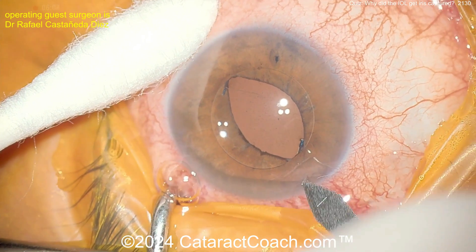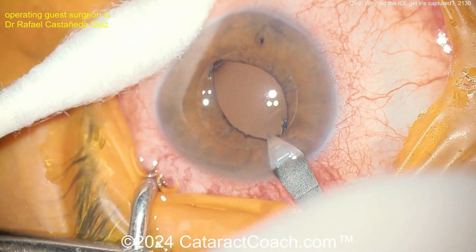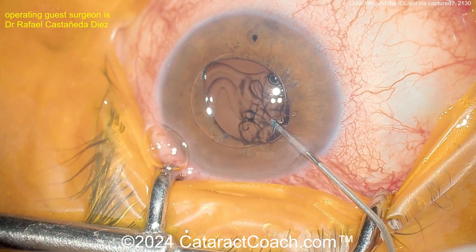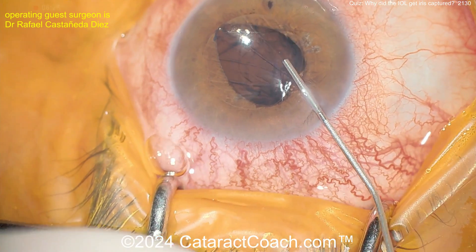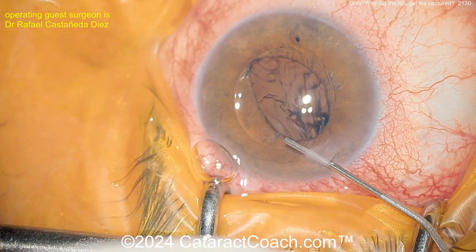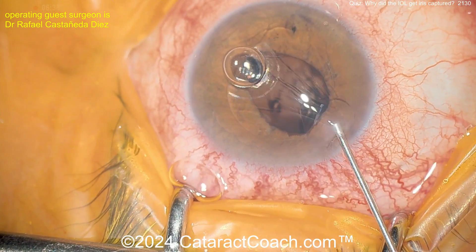Think about it — I don't want to give away the answer just yet. Our guest surgeon is going to do a great job and fix this issue. How are you going to fix it? Do you need to do a Yamane? Are you going to suture it in place? There must be some sort of capsule support — do you want to put some iris hooks in to see? What do you want to do here? Have you figured it out yet? It's pretty easy once you see it.